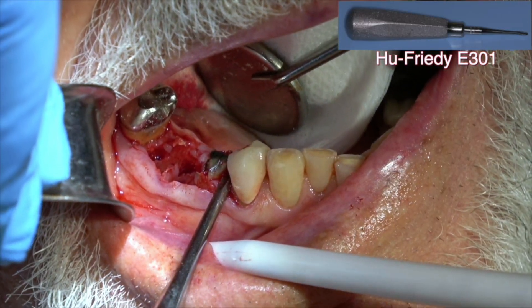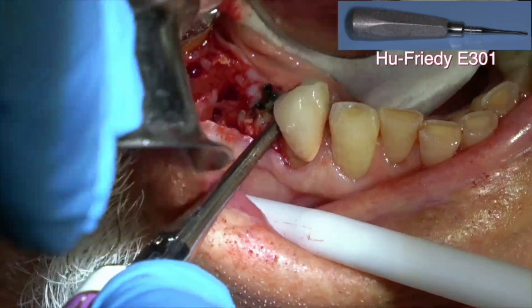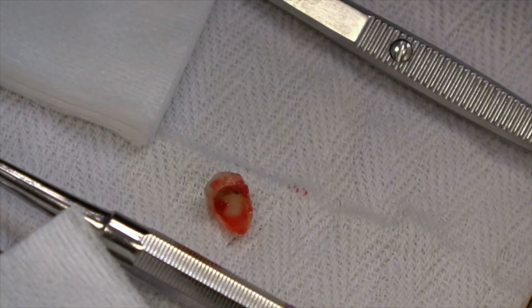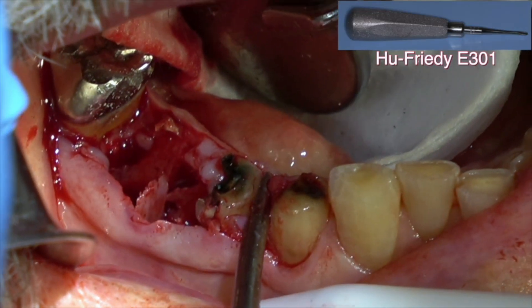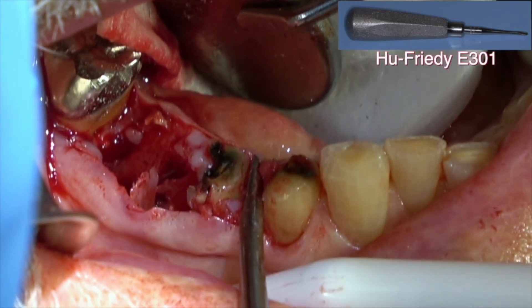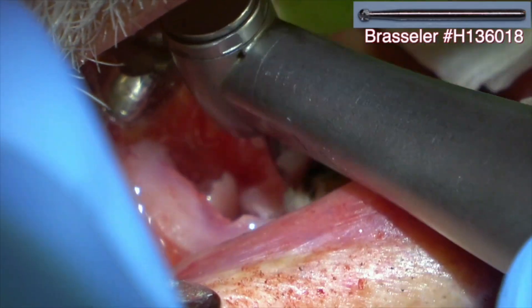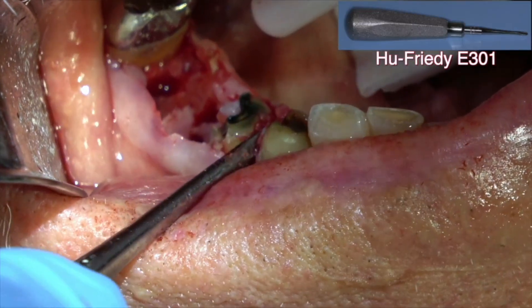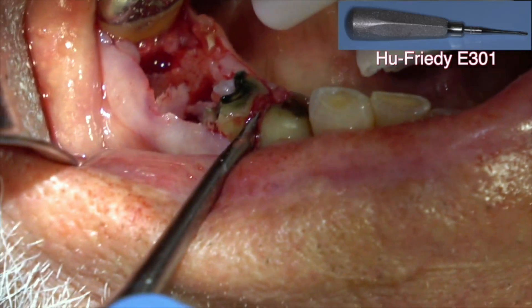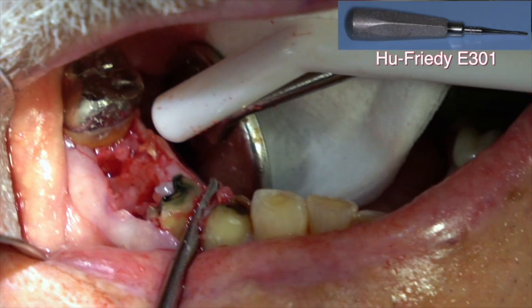Lots of decay, brittle teeth — there goes the crown off the tooth in front of it. This is real-world dentistry; this is what happens. I'm going to go ahead and extract that second bicuspid, which is just like concrete. If you've extracted many teeth you know this happens. I was in an oral surgery fellowship for two years, so for two years all I did was extract teeth, wisdom teeth, and place implants. I have extracted a lot of teeth.